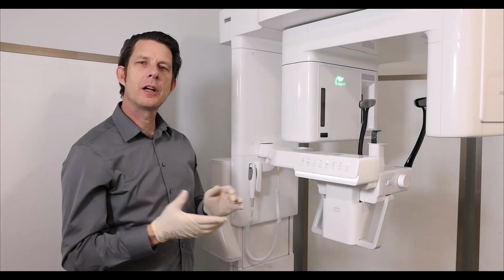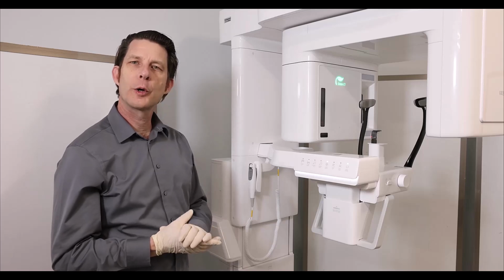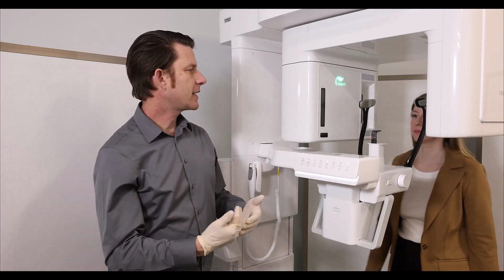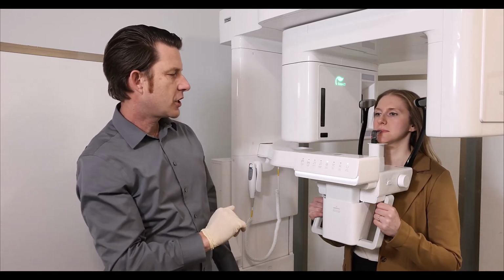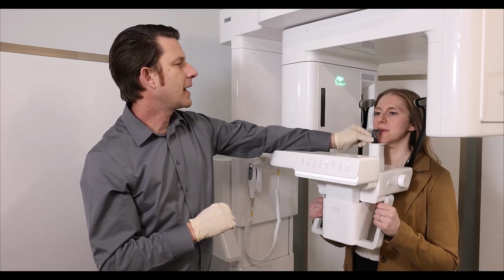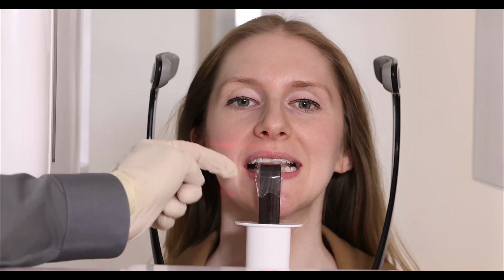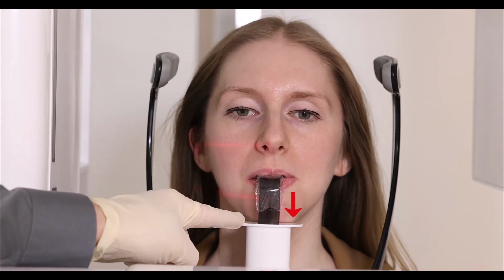We're now going to position our patient for a 4x4 field of view on the GreenX platform. Go ahead and bring my patient into the device. Go ahead and stand up straight and tall. I'm going to go ahead and evaluate her chin to the chin rest. That looks like it is in the proper position. Go ahead and have our patient bite into the bite stick groove. Have her smile. I can see she's in the bite stick groove there. I'm going to push down to ensure the chin is firmly on the chin rest.